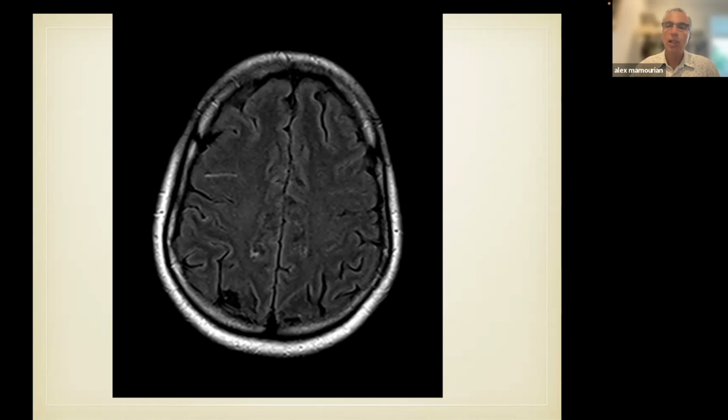Do we do an MR scan in those patients? There isn't one algorithm. Do they do a CTA rather than the lumbar puncture? I can't really advise about the clinical part of it, but from an imaging point of view, a negative CT scan does not exclude the possibility of a ruptured aneurysm.